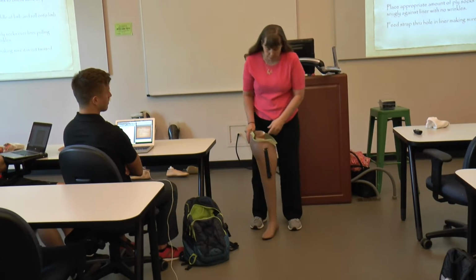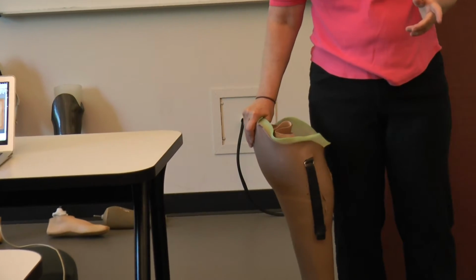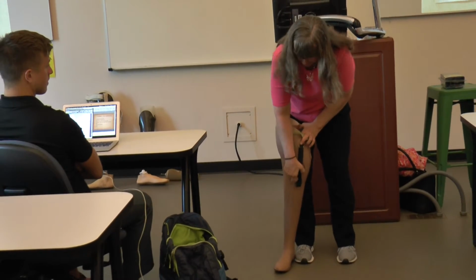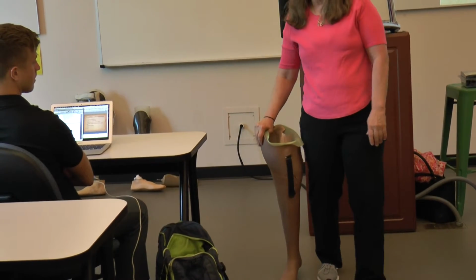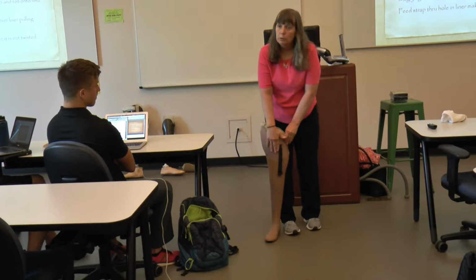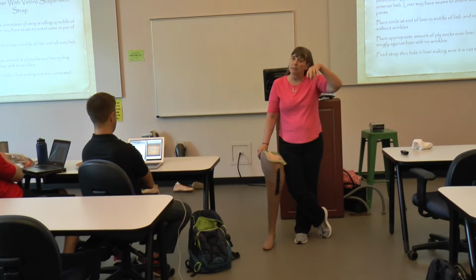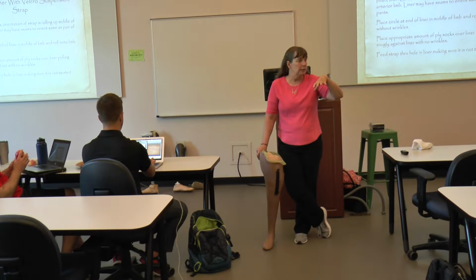So the first thing you do is stand up, wiggle, and try to push it in. The next thing you have them do, holding on to support, is pick up their sound side so that they put weight on it about 5 times. Pull it out of the hole, and then tighten the strap a little more. Then you have them step the sound side back and forth about 5 times and try it one more time. I encourage patients, because when they walk, if their limb settles deeper, it makes the strap loose. It causes some pistoning and causes some problems, okay?